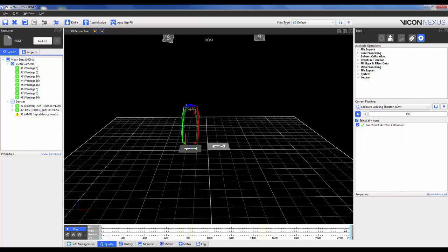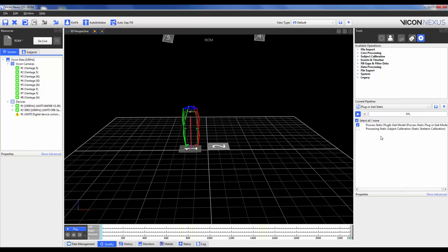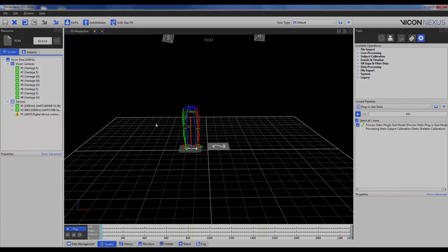Once it's complete, we can scrub back to the first frame where they're in the static position and we can go in and run our plugin gate static, just like we normally would. Now we can go in and save the trial and then process our dynamic trials like normal.